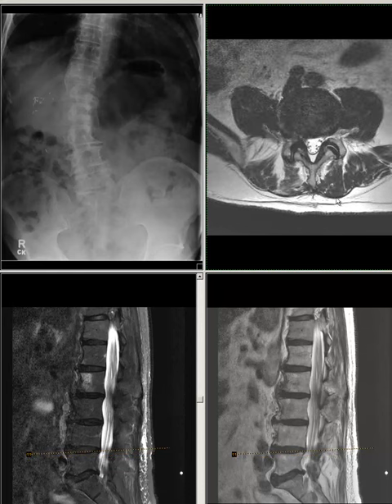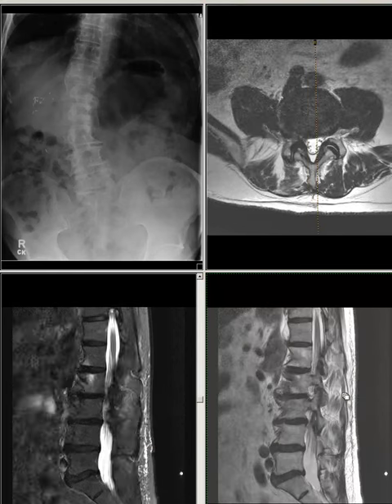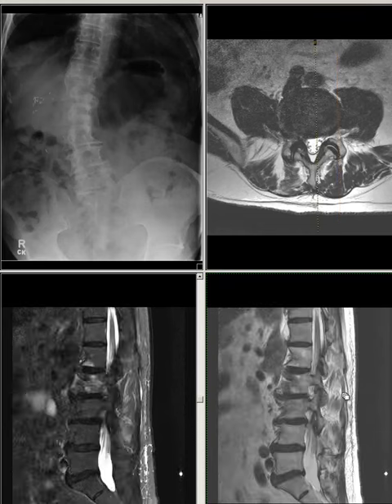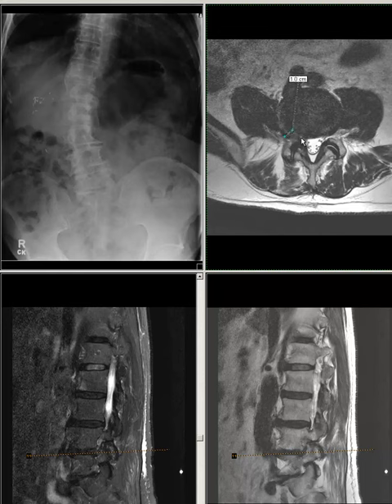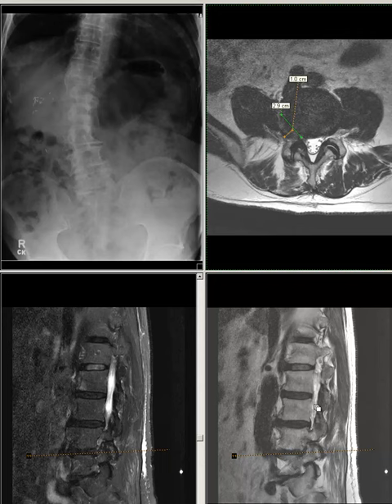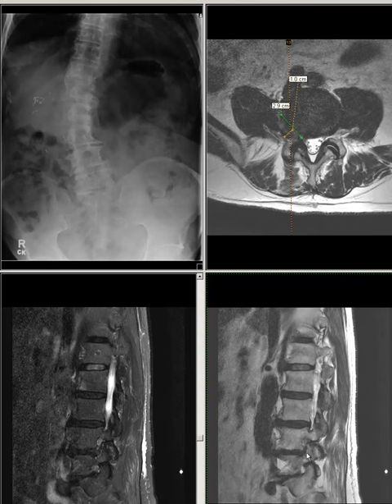L4-L5: There is disc desiccation, disc space narrowing, and broad-based disc bulge. There is a right-side foraminal broad-based disc-osteophyte complex protrusion measuring 2.9 centimeters in width and 1 centimeter in maximum radial dimension.